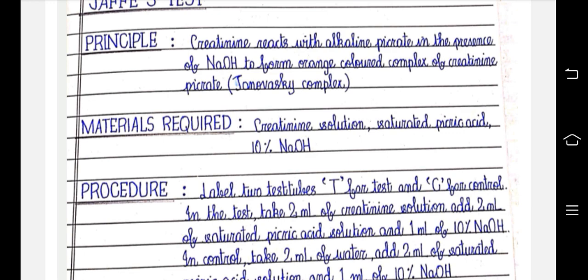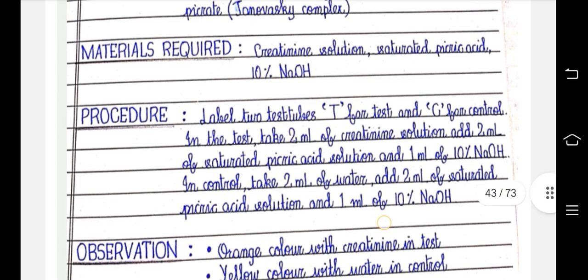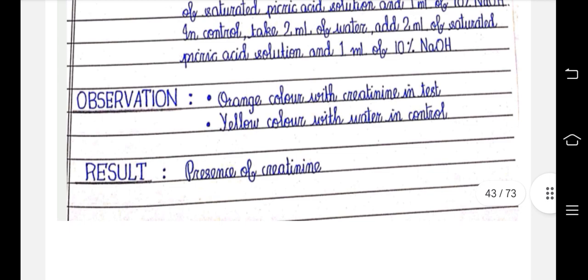Procedure. Label the 2 test tubes, T for test and C for control. In the test, take 2 ml of creatinine solution, add 2 ml of saturated picric acid solution and add 1 ml of 10% NaOH. In control, take 2 ml of water, add 2 ml of saturated picric acid solution, add 1 ml of 10% NaOH. Observation: orange color with creatinine in test, yellow color with water in control. Presence of creatinine.